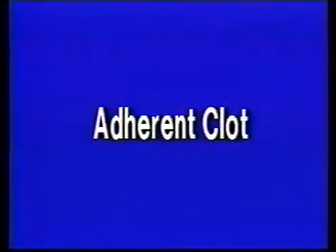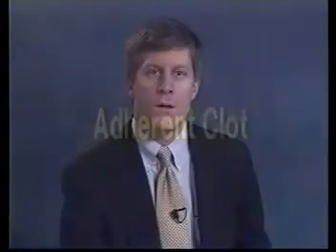How do you treat a clot that adheres to the graft wall? The PTD is usually successful in removing all the clot in the graft with only a few passes. Occasionally, adherent clot can occur. When it does occur, we find it useful to use the device in a back and forth or toothbrushing motion to get the adherent clot off the wall of the graft.